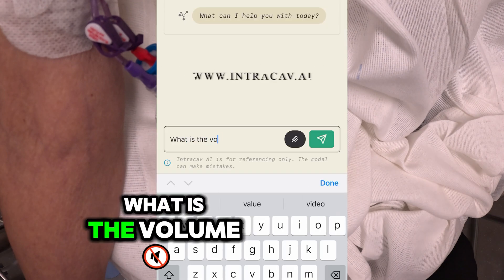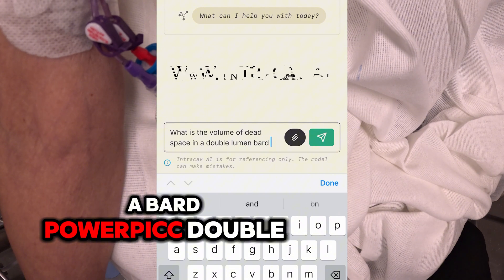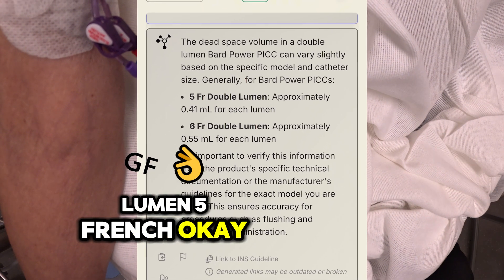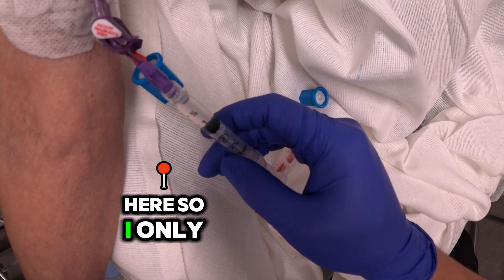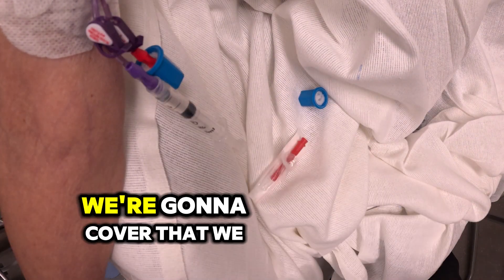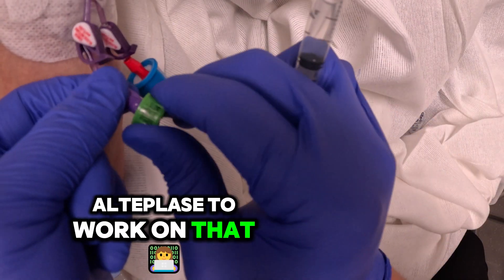What is the volume dead space inside of a Bard Power PICC double lumen 5 French? It's 0.4. There's plenty in here so I only put in 0.5. We're going to cover that, clamp it, and allow the TPA — the alteplase — to work on that.